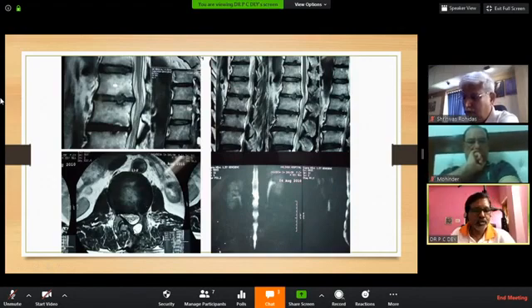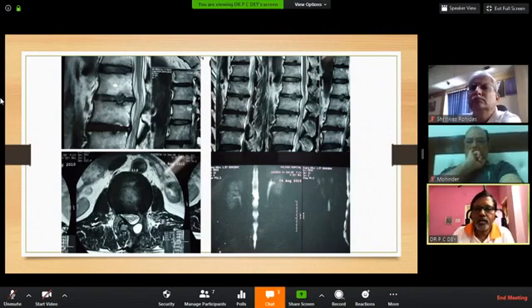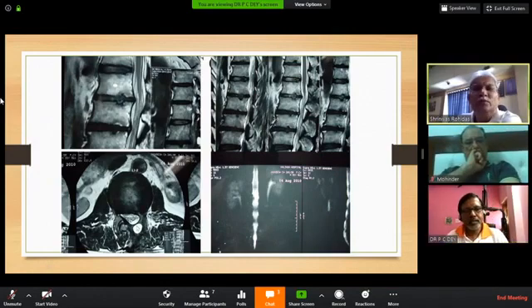I just would like to ask Dr. Rohidas, what is this? Unmute. Dr. Rohidas, unmute, please. Yes. Now, what is this white glistening structure here? Is this pre-op or post-op? This is post-op. This is dural, the CSF collection.